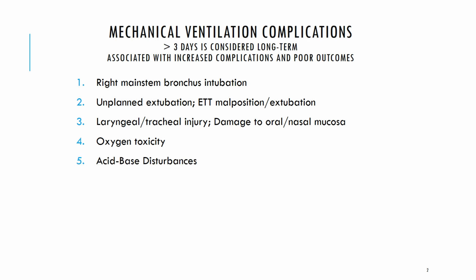As you can imagine, mechanical ventilators are changing our respiratory rate and our ability to exchange oxygen and carbon dioxide, as well as our patients' metabolic needs, how hard they're working, right? If our ventilator isn't helping the patient enough and they're having a really hard time breathing, their metabolic needs are going to go up. So the patient's ABG could definitely be impacted.